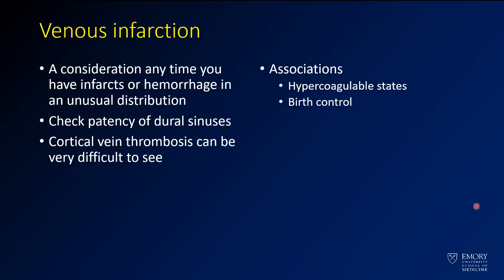Any time you have infarcts or hemorrhage in an unusual distribution — and crossing the tentorium was very unusual — the combination involving the right basal ganglia as well as the cerebral and cerebellar hemispheres was a little unusual. So you've got to look at the dural sinuses. Cortical vein thrombosis can be very difficult to see, but you definitely want to check the bigger sinuses.